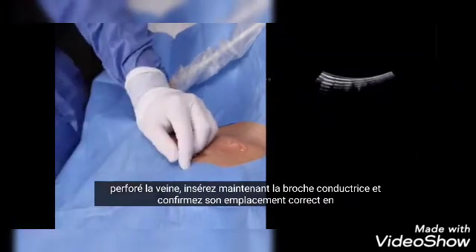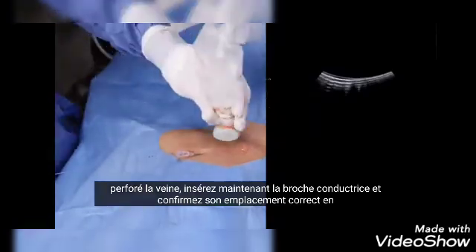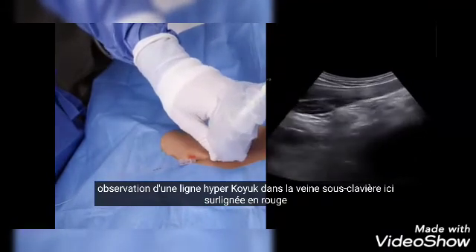Aspiration of dark, non-pulsatile blood indicates that we've successfully punctured the vein. Now insert the guide wire and confirm its correct location by observing a hyperechoic line in the subclavian vein, here highlighted in red.